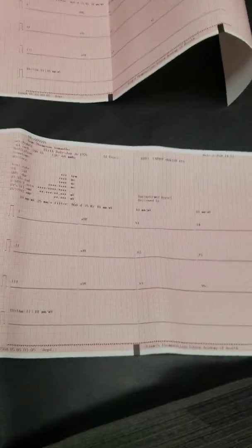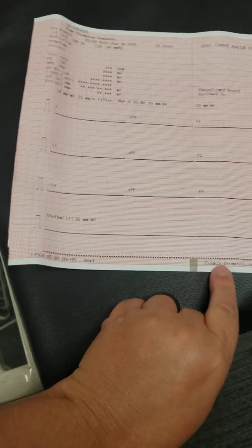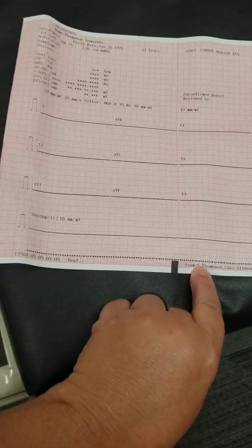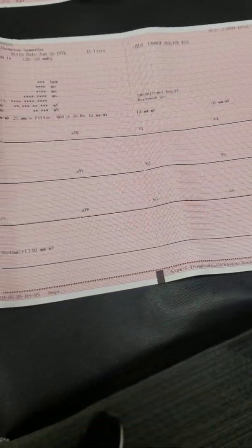You will see that it printed out all of the information. It will print out the tech name down here at the bottom. It gives you the date and the time that it was done, so you always want to verify that those are correct.